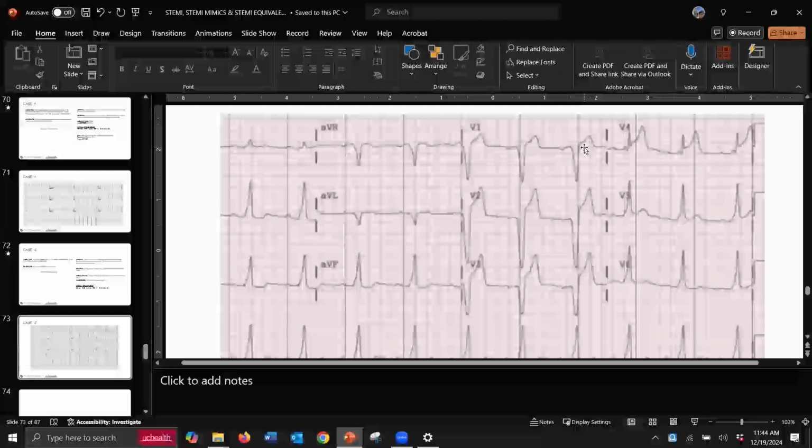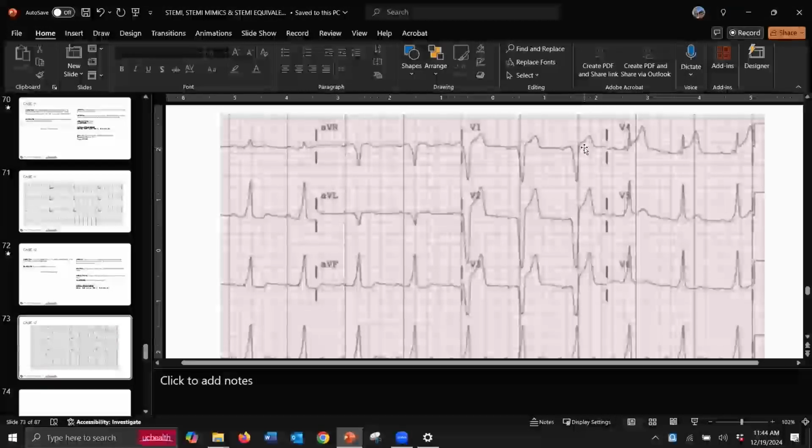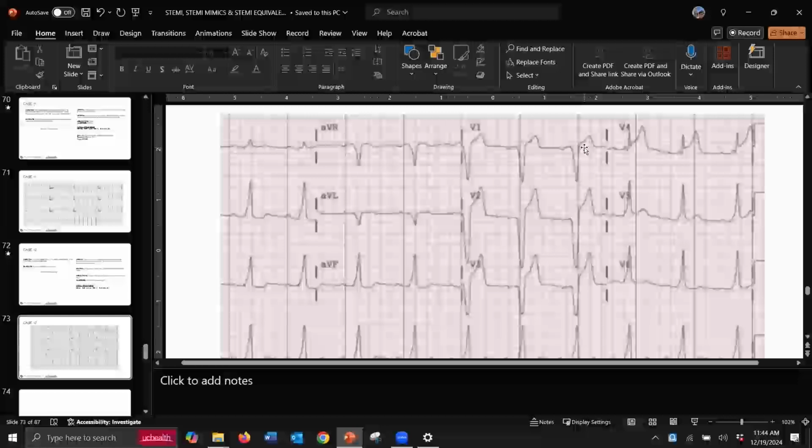Understand that even something as simple as looking at the vital signs and correlating them, going back to our last PE guy, right? It wasn't a slam dunk EKG, but what made that EKG correlate was the fact that he was hypoxic, with a respiratory rate of 26 and a SAT of only 94, and tachycardic and hypotensive.